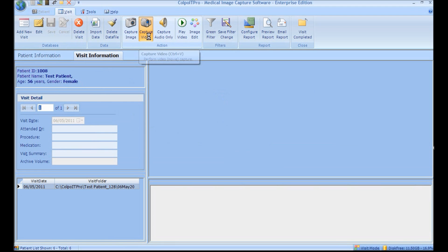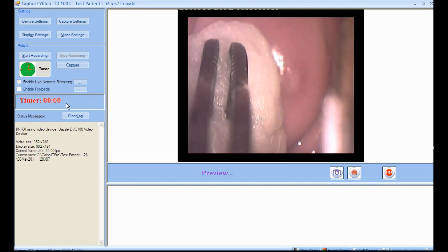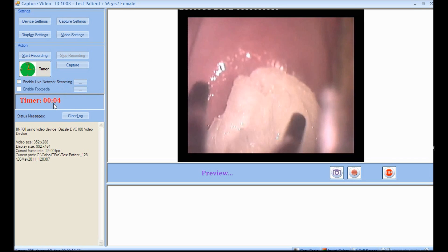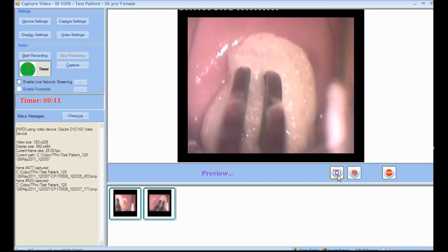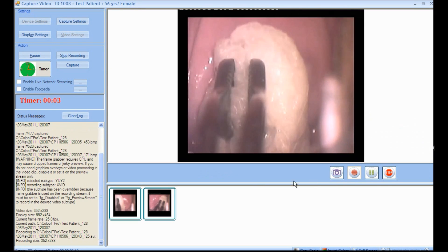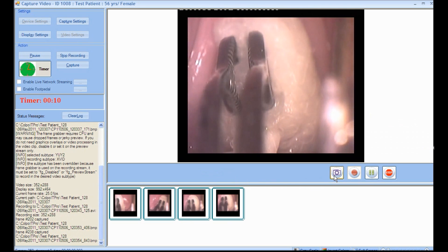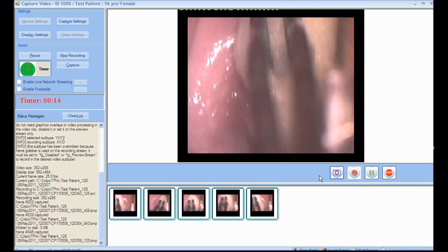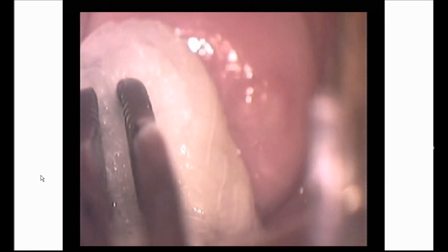To capture video, click the Capture Video button. A timer is provided for timing options. Snapshots can also be taken in video mode by clicking the Camera, Capture, or F5 button. To record video, click the Start button. To view full screen, press F10. Even in full screen mode, images can be taken by pressing F5 and it is indicated by a beep sound.